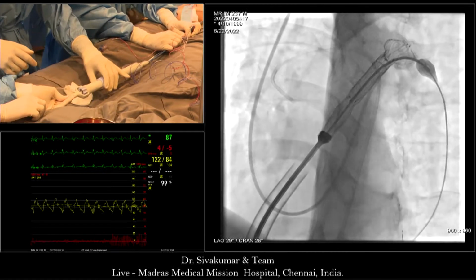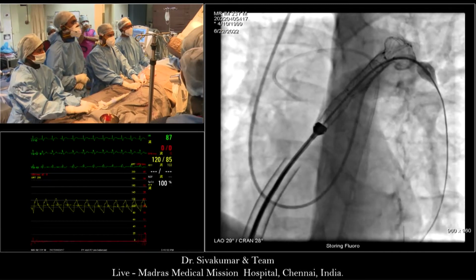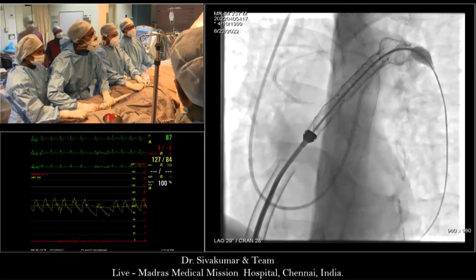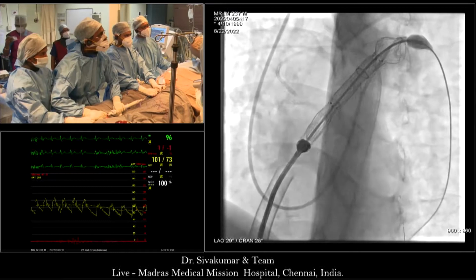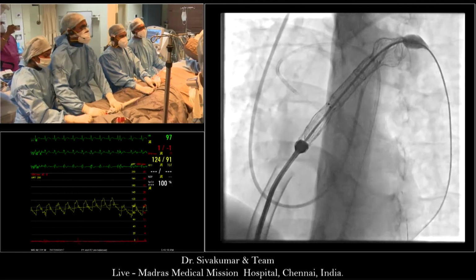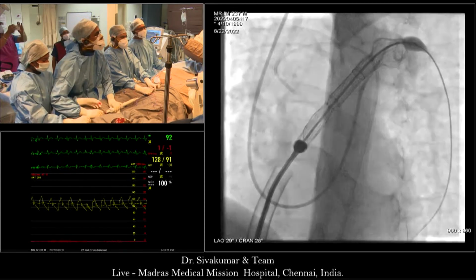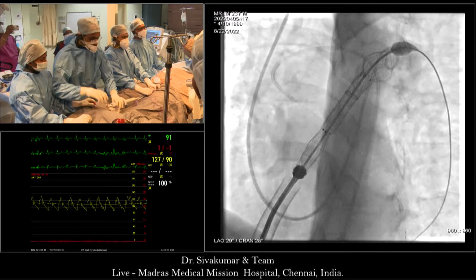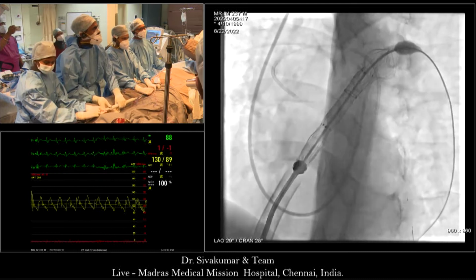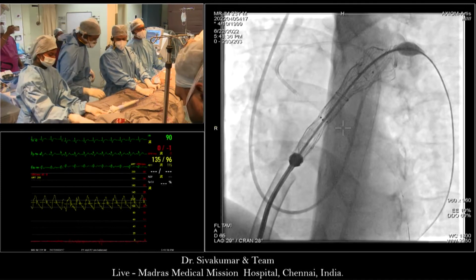Okay. Now, can you make another angiogram? Okay. So now I'm going to pull back. Okay. Show me one more angiogram. Shiva. Yep, Shaq. When you've done the angiogram, just take your time, relax, and review before the next step. Otherwise, you might rush it. Yeah, I understand.